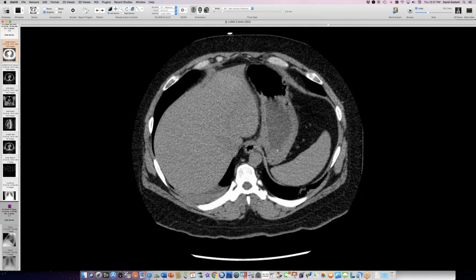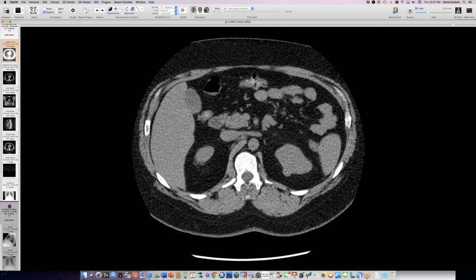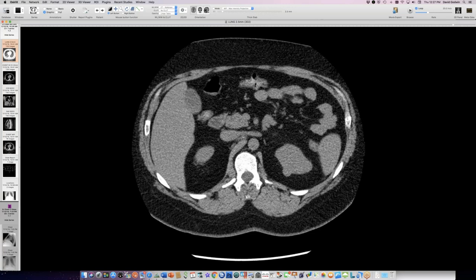And we get down to the kidney, you can see that there's this little tumor. The person was in the hospital for a follow-up scan on this little renal tumor. This is known Birt-Hogg-Dubé disease. None of the notes mentions any skin findings, but fibrofolliculomas would be the third finding. This little lesion, when they did these elaborate abdominal CT scans, was very slow to enhance, and it didn't enhance brightly like renal parenchyma or like a renal carcinoma. It was unchanged in size over the last 2 years, but might have grown slowly from a year before that. So very slow growth here.